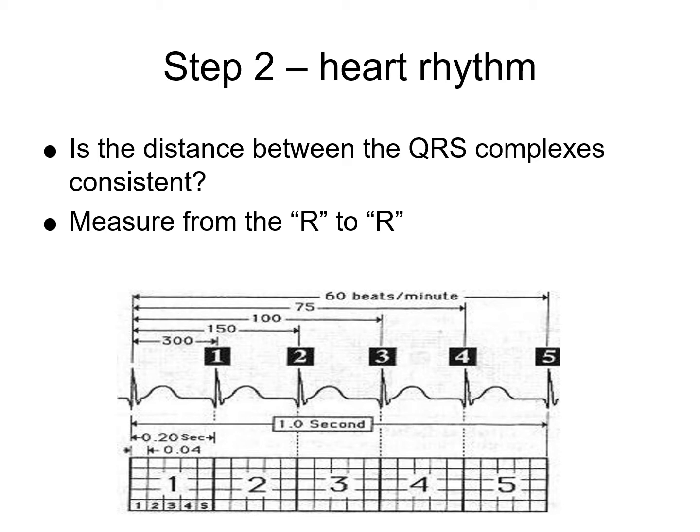Remember, if you're looking at the R's, you're looking at the ventricular rate, and if you're looking at the P waves, you're looking at the atrial rate. This is terminology that can get confusing, and I think the Banner ECG study guide can definitely help you with this too. There's the terminology of regularly irregular, occasionally irregular, or irregularly irregular. I remember one of the first times I taught this class, a group of girls I was teaching, it threw them for a loop. They hated that terminology.